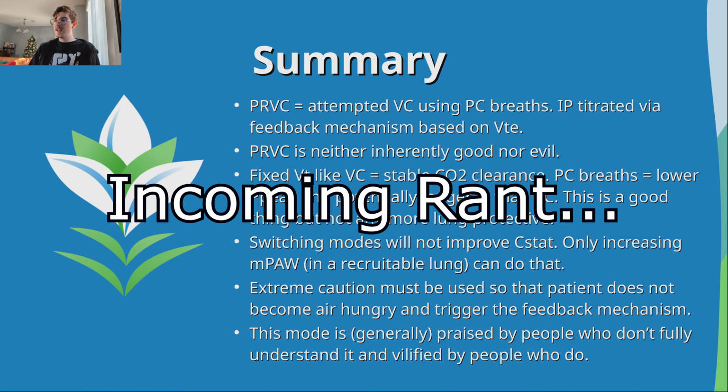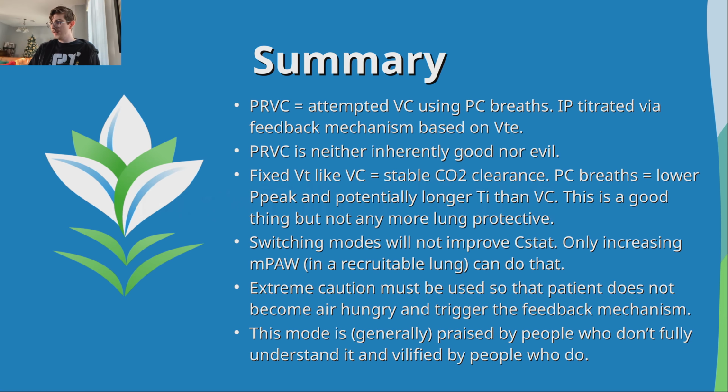Now, I'm not saying that means PRVC is bad. I'm not saying that you should or should not use it. I am just saying that a lot of the times when I've seen praise of PRVC, it's people claiming that it's more lung protective and it's great because it's automatically titrating the pressure. That's really not an advantage. You know, is it a bad thing? Like, no, of course not, but that's not the flex that you think it is, okay?